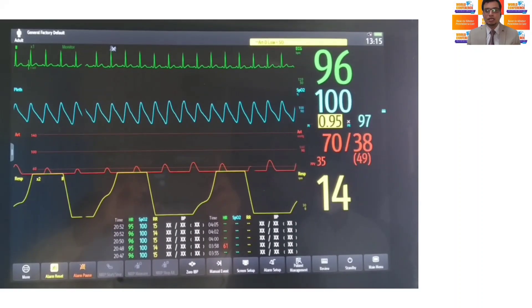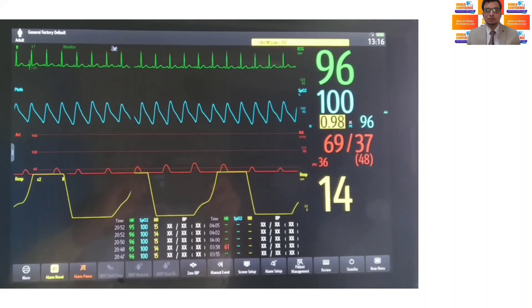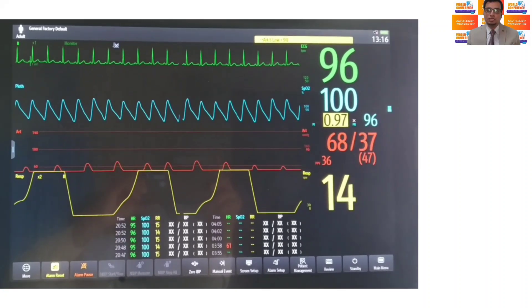In this example, in this video, you could see the PPV of 35% and hence this patient is considered to be fluid responsive.